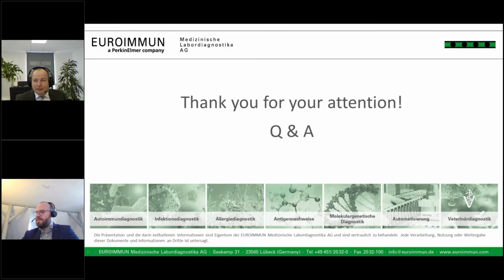Okay. Another question was, does the computer report the patterns with the ICAP code? I think they mean the AC code, AC1 through I think 29 at this point, or 0. Actually, 0 is negative, and it also exists. Yes, exactly. We report with ICAP code, and depending on country, we can put translation for you in German, in Mandarin, in Spanish, and so on. Yeah, a global company, global language set, right?